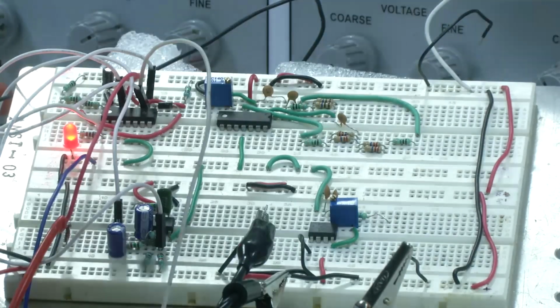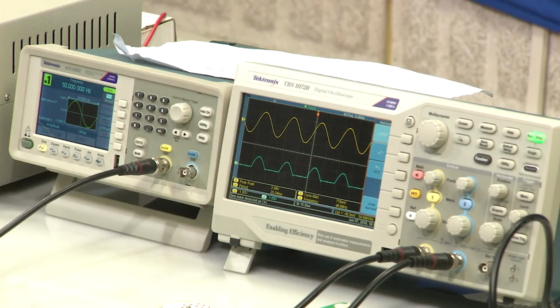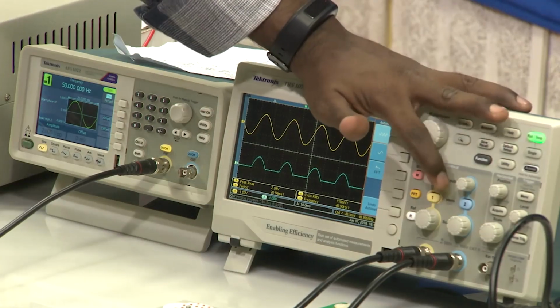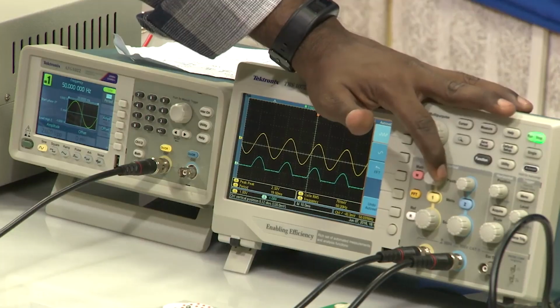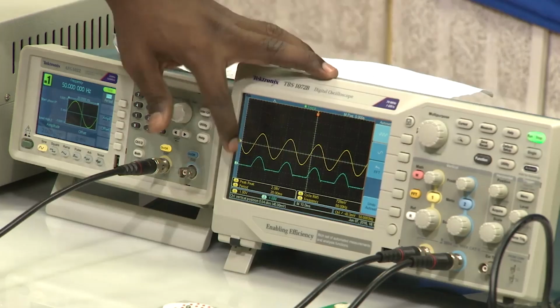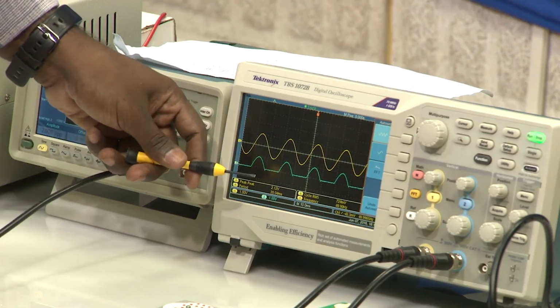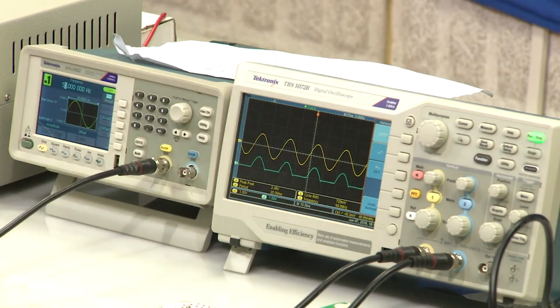Now let me auto set it. We can keep it at any frequency, there is no problem. When we look into the oscilloscope, from the signals it is clear that only one peak we can see in the output, and the other peak we cannot see. That is because of half-wave rectifying. We are removing the complete negative peak of our input signal by using a simple diode.